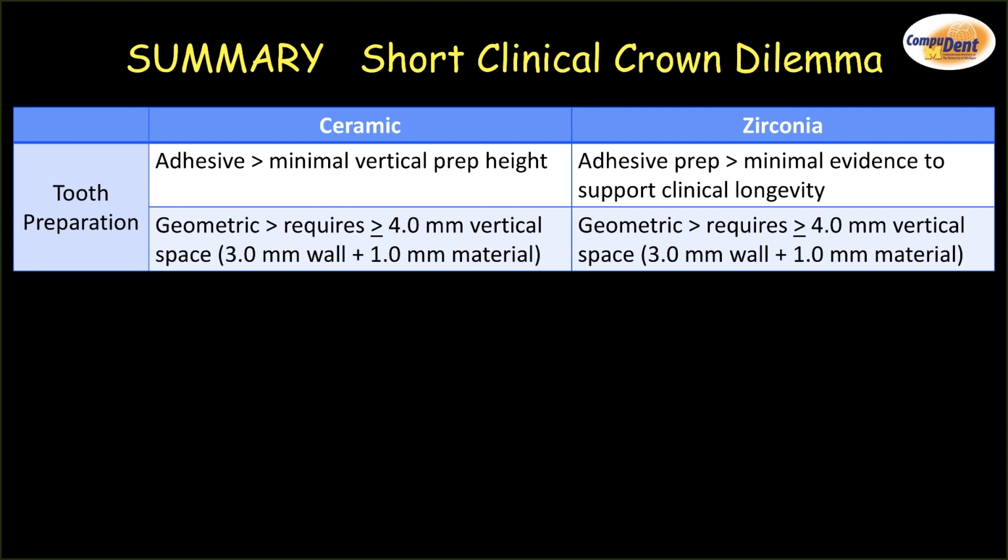On the other hand, for zirconia, we don't have evidence that those kinds of bonded overlays or onlays are going to have long-term retention. We don't know that because most of the clinical research when it was done with zirconia, the advantage of zirconia is its strength and people would rather cement it. Well, you can't cement it in those types of preparations. Bonding zirconia came along after the fact when people were trying to put them in places that didn't have a lot of space and they weren't having success. So could we begin to bond?